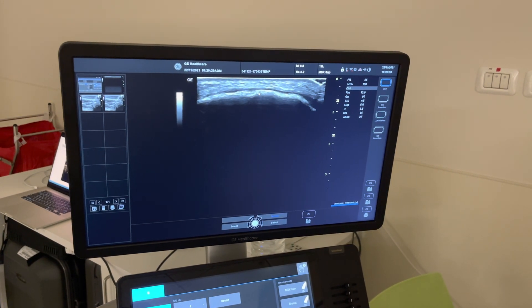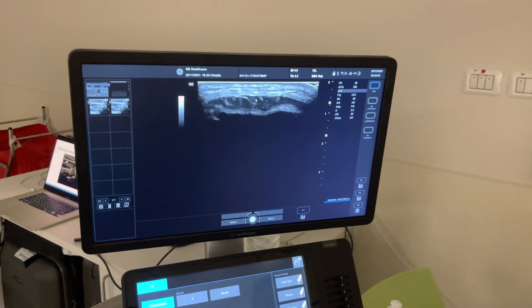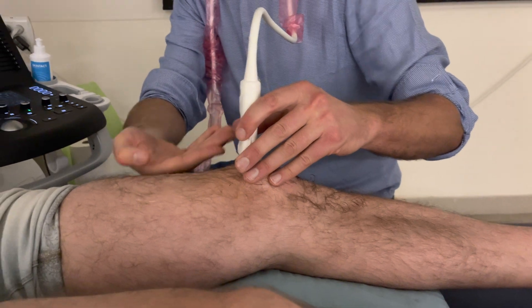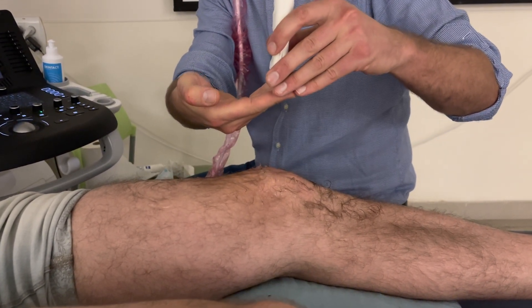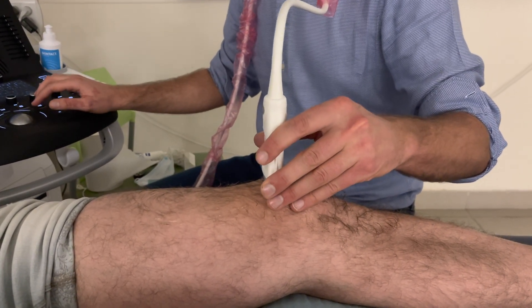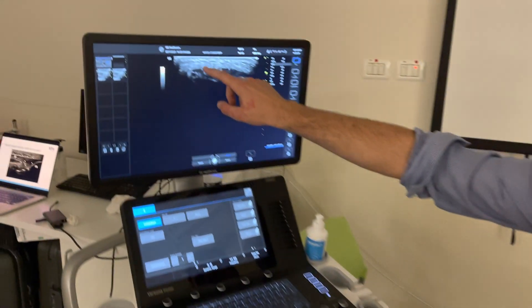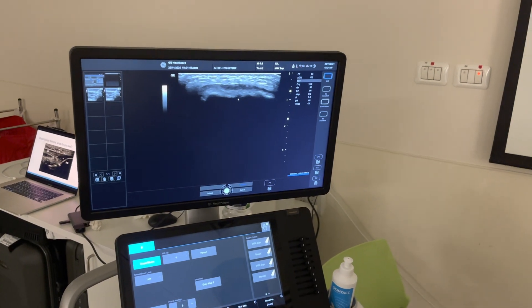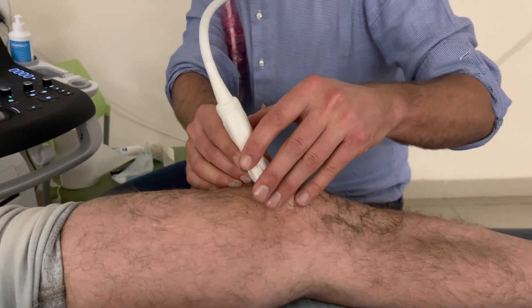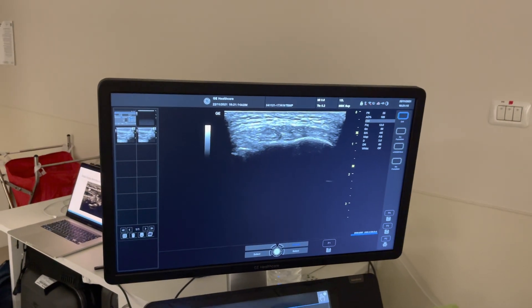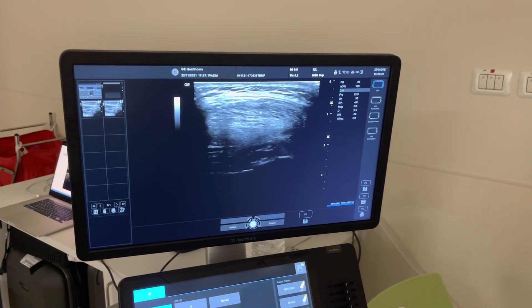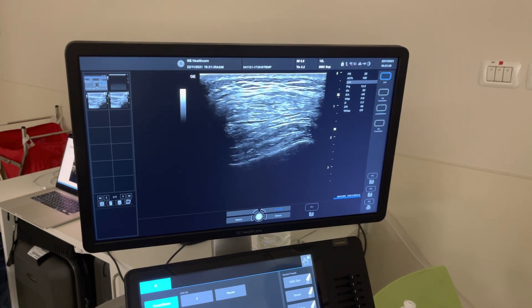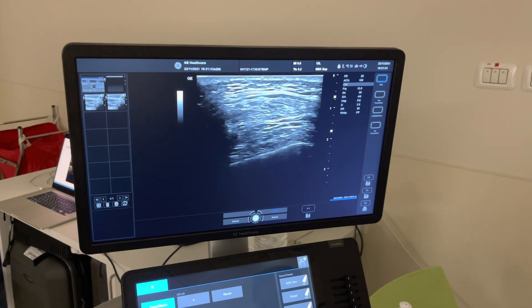Continuing cranially in short axis, we reach the quadriceps tendon. The probe is still in the same plane, but the tendon is coming up from a different direction — so we're not scanning perpendicular to the fibers. This causes the tendon to become completely full of anisotropy. To fix this, you take your probe and angulate it toward the fibers — toward the bone, perpendicular to the tendon fibers. Now we can see the tendon properly. Going more proximal, the quadriceps tendon is not as clean as the patellar tendon or the Achilles tendon because it's comprised of three different tendons or three lines.